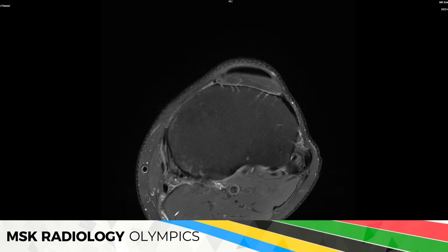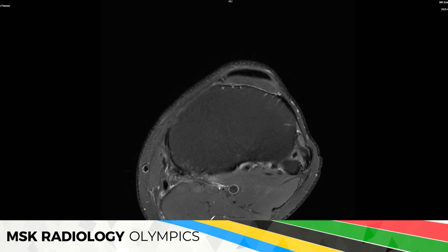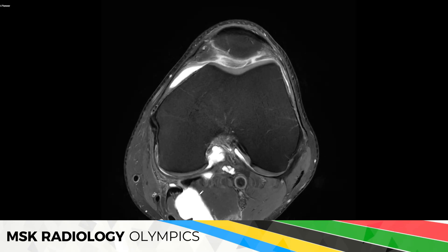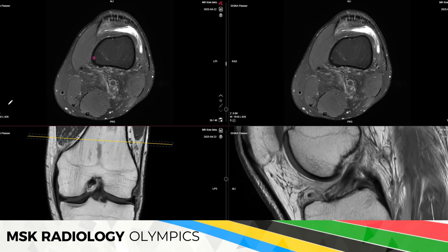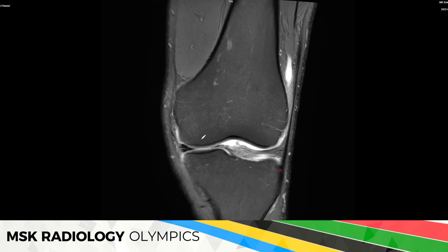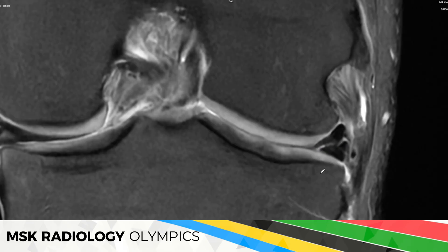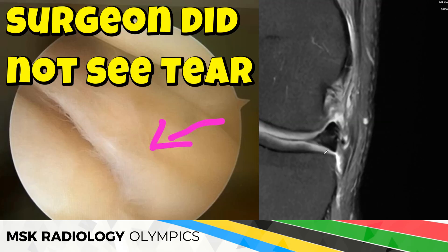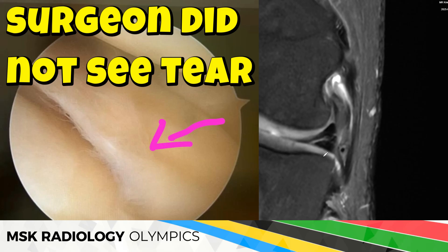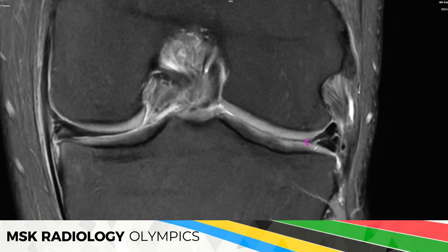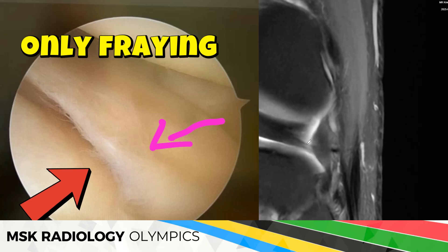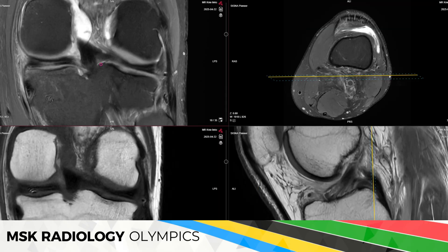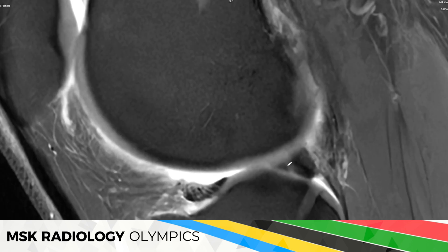We see a large Baker's cyst with some leakage or perifocal edema, and some focal edema in the medial gastrocnemius head suggesting a little myofascial strain of the muscle. The pes anserine tendons are otherwise okay — that's all on the medial side. Moving to the lateral side, the meniscus shows a signal change that seems to reach the undersurface. I would still count this as a horizontal tear, but intraoperatively it was not confirmed. There was some fraying of the free edge.